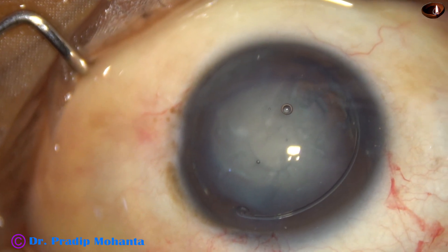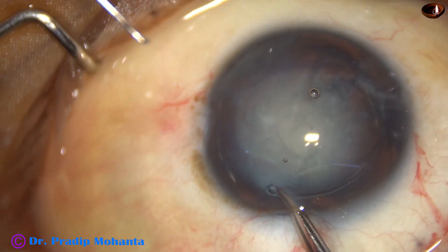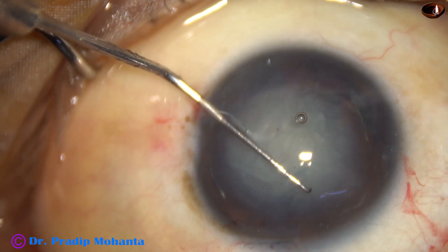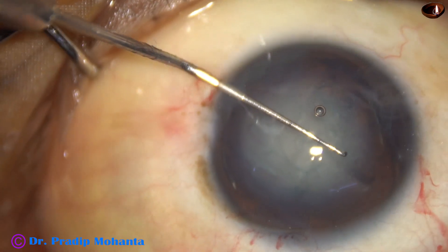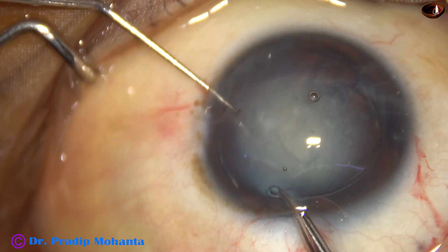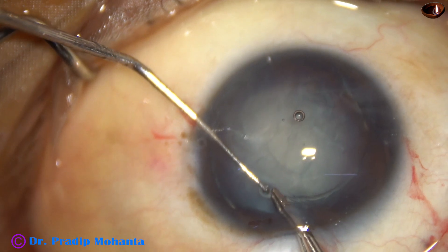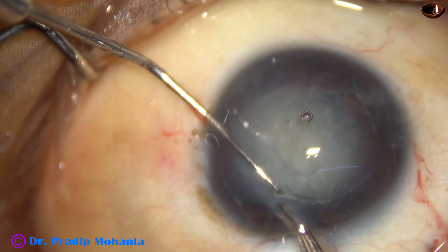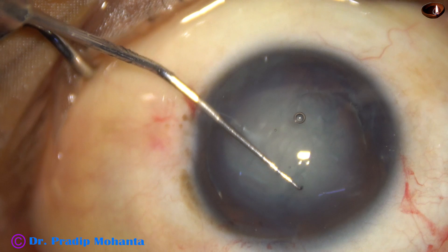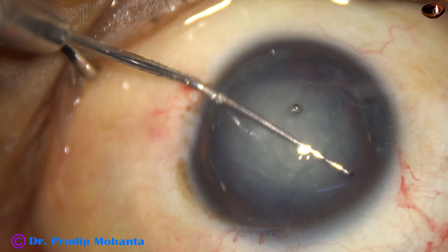The CTR supports the capsular bag nicely. And now, I use a Sinski hook in my left hand, and with the McPherson forceps I hold the trailing end. The trailing end is placed in the bag, but it went suddenly. So, let us see this in slow motion — at one-third of the normal speed — whether it went into the capsular bag or somewhere else. The Sinski hook releases and the CTR goes into the capsular bag.